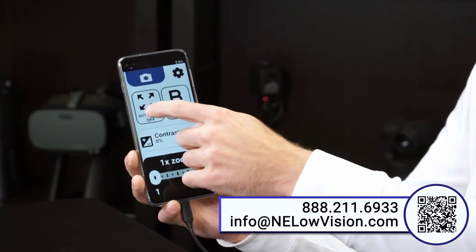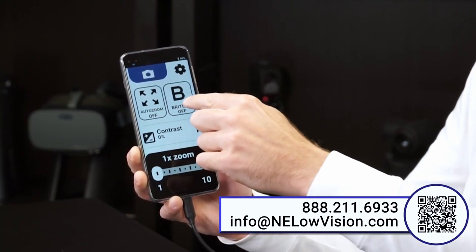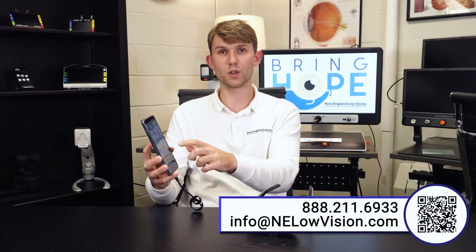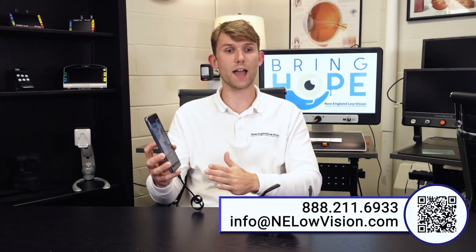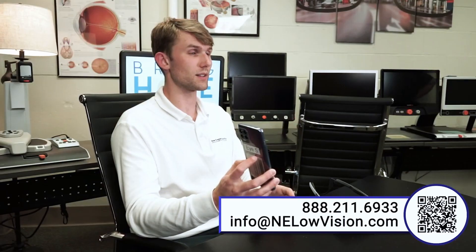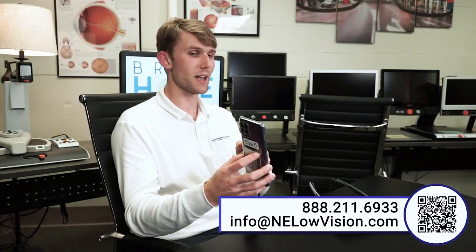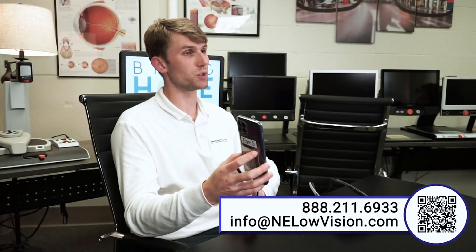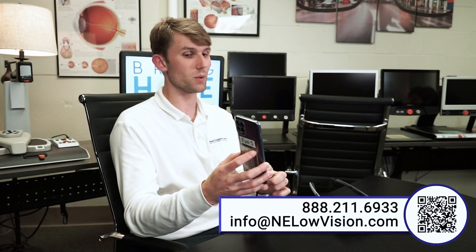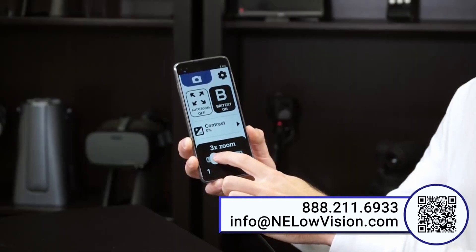We also have a couple of options below our camera mode: auto zoom and bright text. Auto zoom is a neat feature that can automatically zoom in on faces or text, and this choice can be made within the settings of the app. Bright text is a nice feature that brightens up the contrast when you zoom in — as you can see, as I zoom in, bright text automatically goes on. That is the basics of the iDaptic i5.